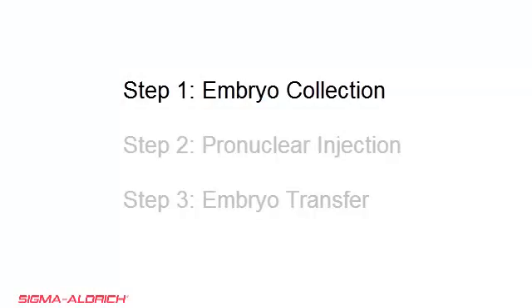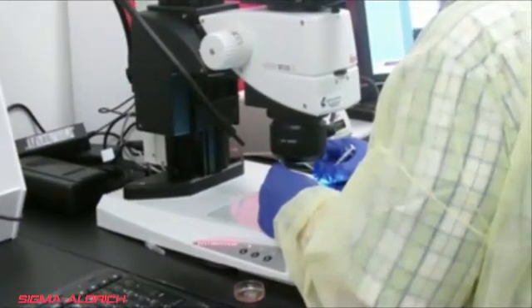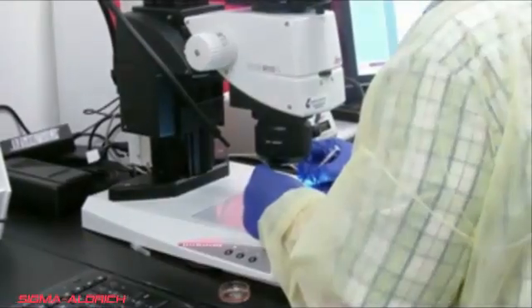Step 1. Embryo collection. Begin by removing the oviduct and placing it in a small dish of media under the dissection scope. Tear the ampulla with a small syringe needle and pull out the embryos into the surrounding appropriate media. We recommend M2 medium for mice.